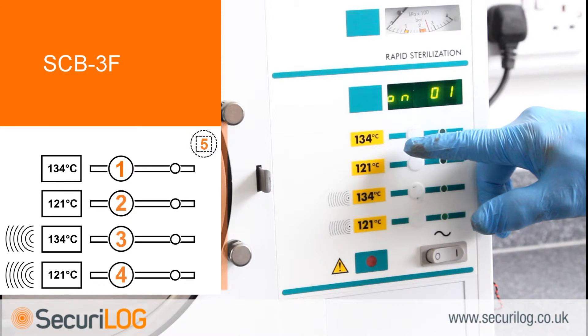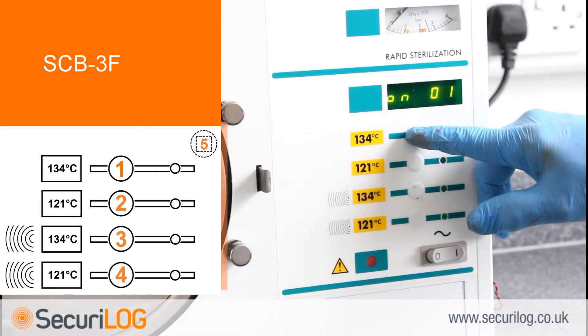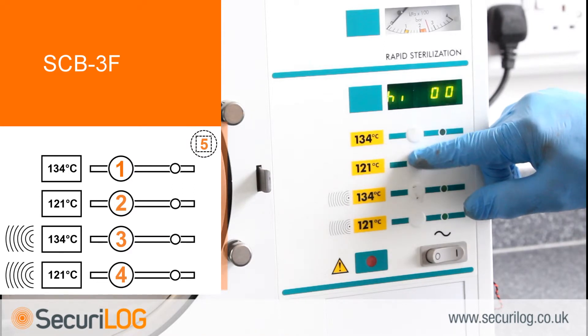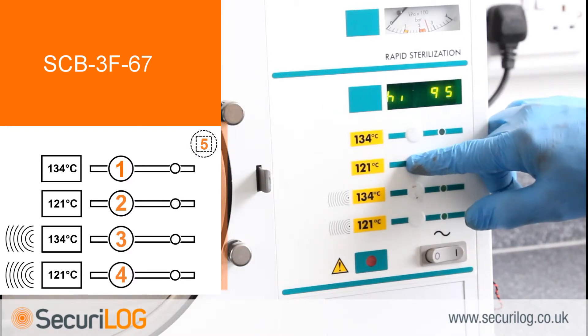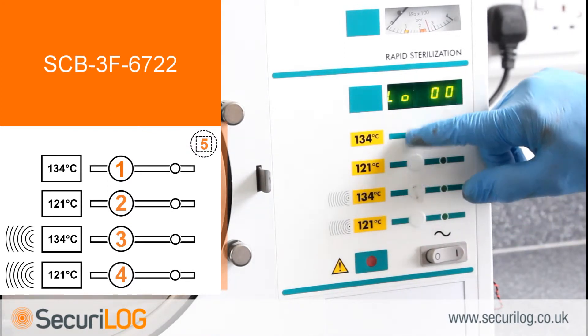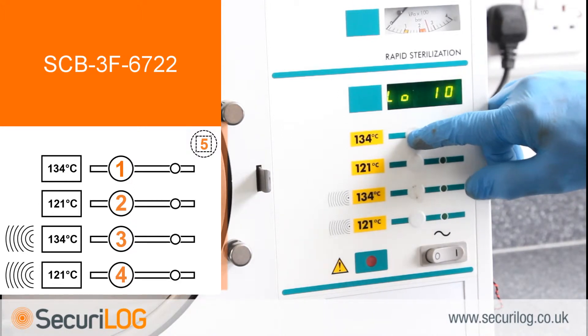Now set up the month of manufacture. The month is made up of two numbers — January is 01 through to December 12. With the display reading ON01, press button 1 to begin selecting the required number; button 1 increases, button 2 decreases. When correct, press button 3 to select. The display will now read 'HIGH00' — set up the machine number using buttons 1 and 2, then press button 3. The display will now read 'LOW00'; again use buttons 1 and 2 to select the required number, then press button 3 to select.